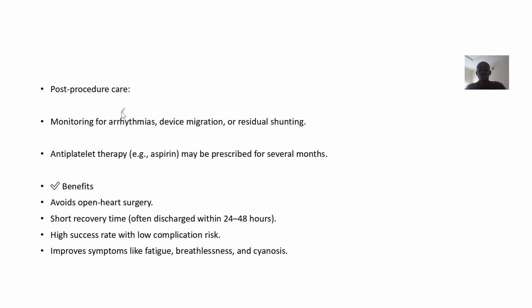Post-procedure care is to monitor for arrhythmias, and monitor for device migration or residual shunting. Antiplatelet therapy, like aspirin, is prescribed for several months.